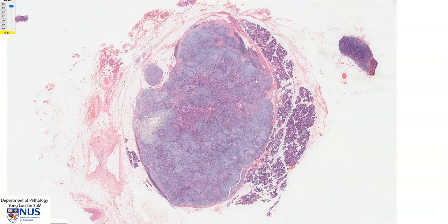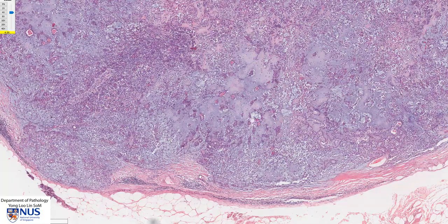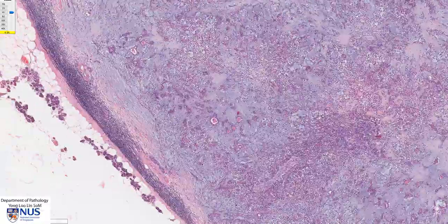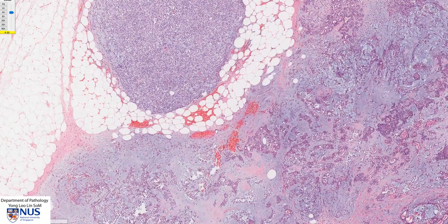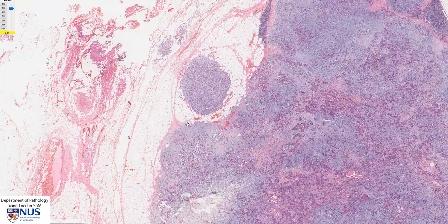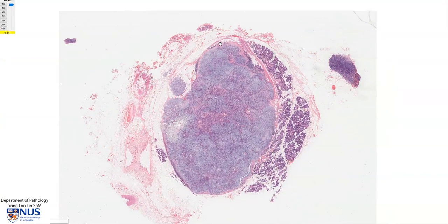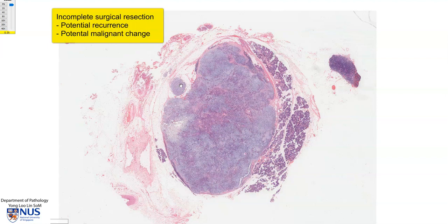Pleomorphic adenomas are one of the commonest benign tumours in salivary glands and often occur in the parotid gland. In this particular tumour, in some areas we can see a fibrous capsule, however in other areas there is no definite discernible capsule, and sometimes you can have nodules of tumour poking out of the original main mass. This is why pleomorphic adenomas need to be excised with a margin of surrounding normal tissue; otherwise, parts of the tumour can be left behind, causing recurrence or even malignant transformation in later years. When pleomorphic adenomas undergo malignant transformation, the diagnosis is carcinoma ex pleomorphic adenoma.